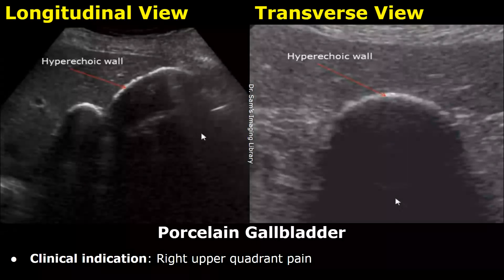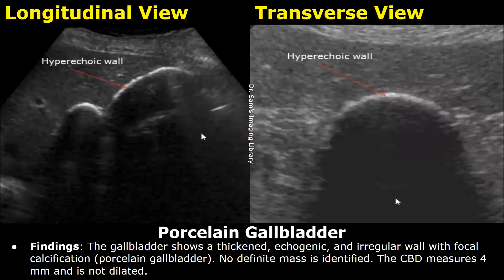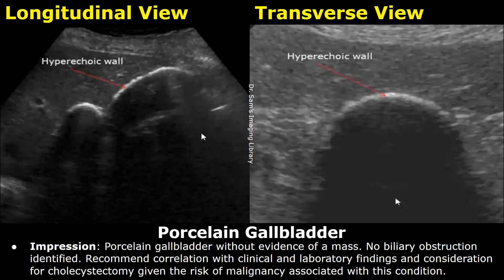This is a case of porcelain gallbladder. The indication was right upper quadrant pain. In the findings, you can write a thickened echogenic and irregular wall with focal calcification. In the impression, you can write porcelain gallbladder — with or without evidence of a mass — and recommend correlation with clinical and laboratory findings, and consideration for cholecystectomy given the risk of malignancy associated with this condition.